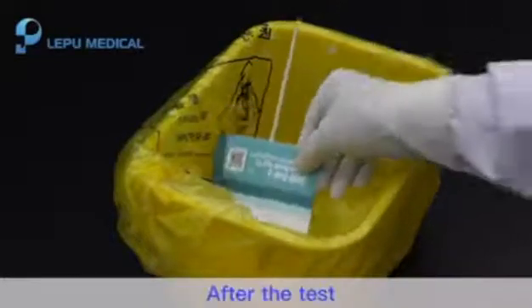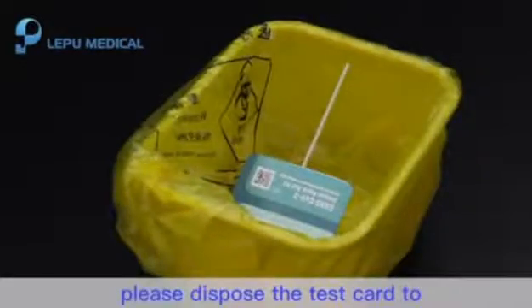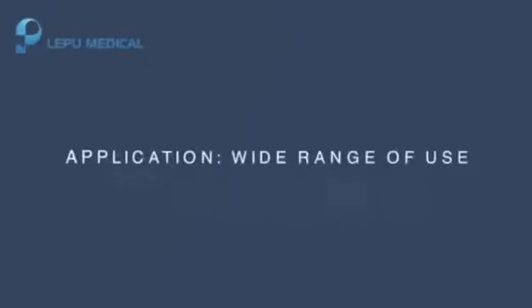Step 7: Dispose of medical waste. After the test, please dispose of the test card in a medical waste bin.